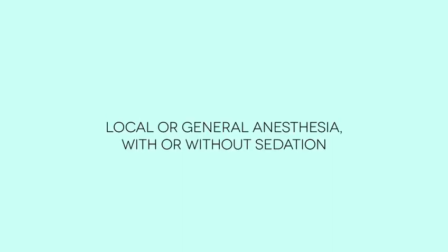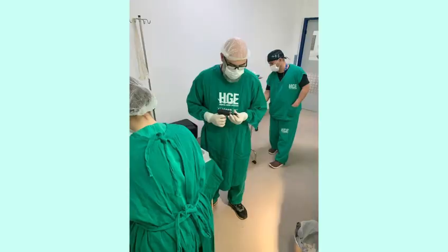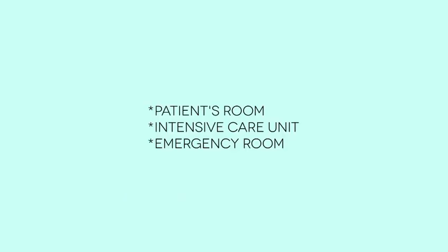The procedure may be done under local or general anesthesia with or without sedation. Depending on the degree of urgency and/or the situation, such as availability of the OR, the procedure may be done in the patient's room, ICU, or ER.